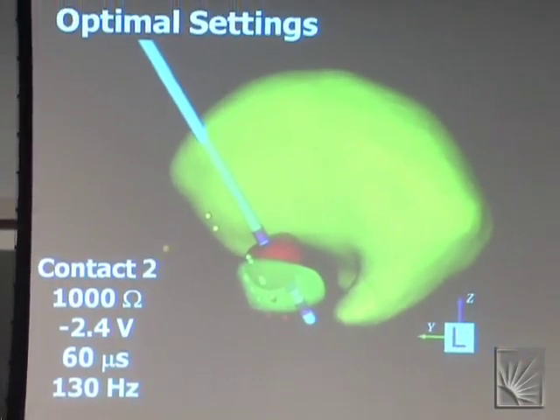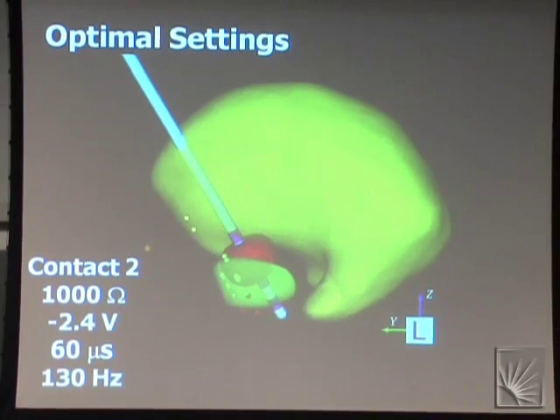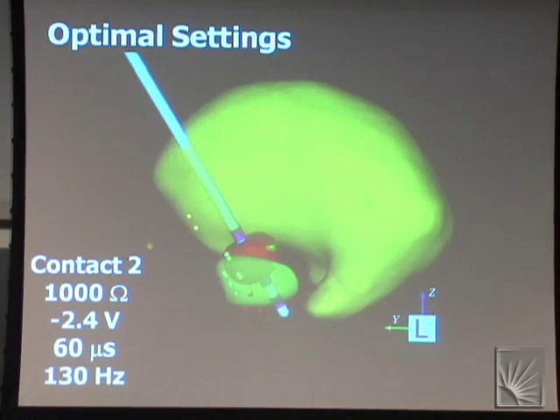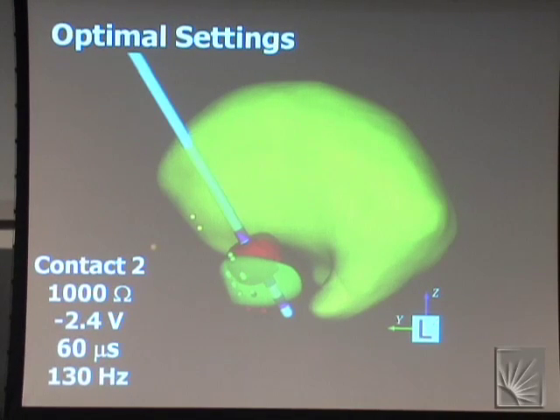They want to define where is the lateral extent, where's the posterior extent, where's the medial extent of the STN. That's a different philosophy in every different mapper, but with the clinicians that we work with, that's their goal.